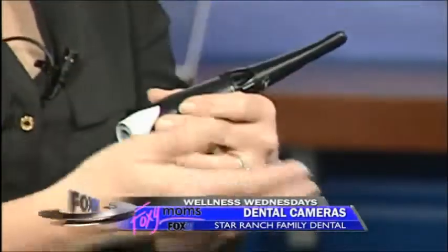There are a few. The intraoral helps with a lot of different aspects, and it helps the patient understand what the dentist is actually seeing. So it's kind of like they're able to look on a monitor and see what the dentist is looking at. Because you hear the sounds a lot, and you hear the dentist often describing what the problem could be, but being able to see it, you understand better, right? Right, and it's hard to get in the back of the mouth and see what's going on with their teeth. They know something's wrong, but they don't know what. So it helps them see. It helps them understand if there's a cracked tooth. It helps them understand if the crown's not fitting right and why we are recommending certain things.